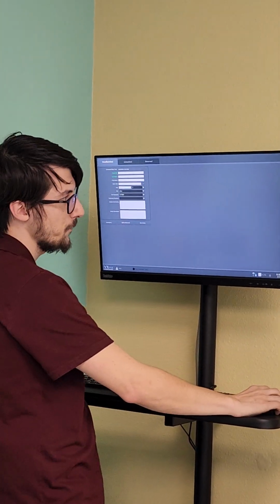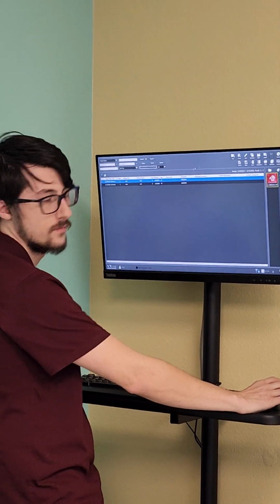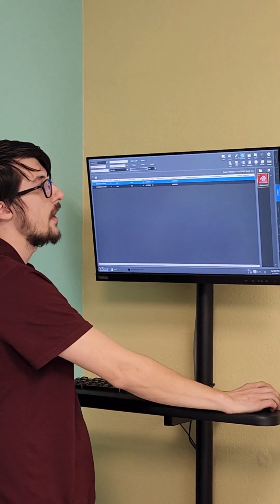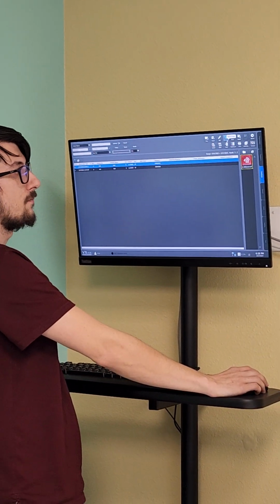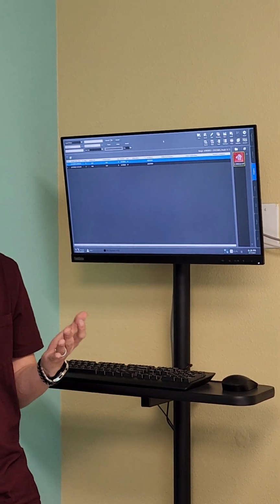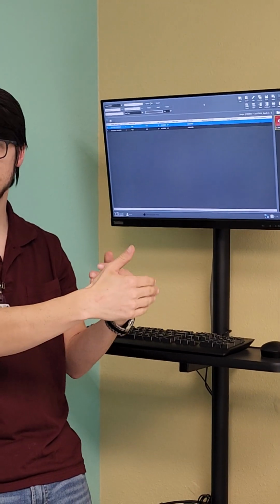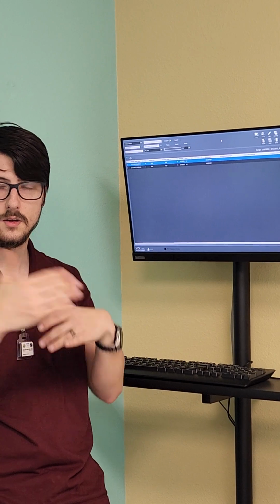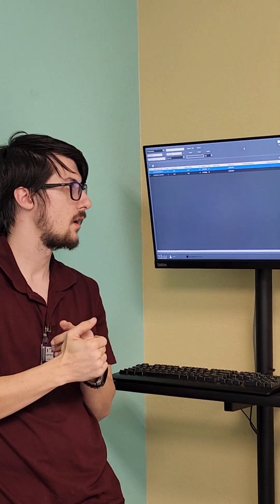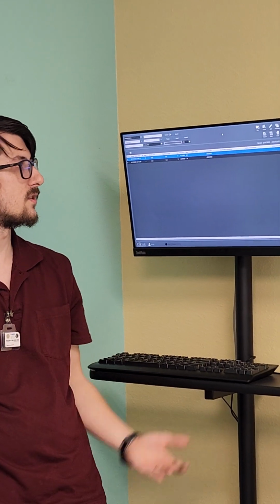So that insert image would be more just like barium studies and stuff, I would think. Edit is edit patient information still. Move an image. Let's say you were just going too quickly and you accidentally took the next pet on the previous pet's study. You can move that image to the correct location, and it'll ask you to move, just follow the steps.